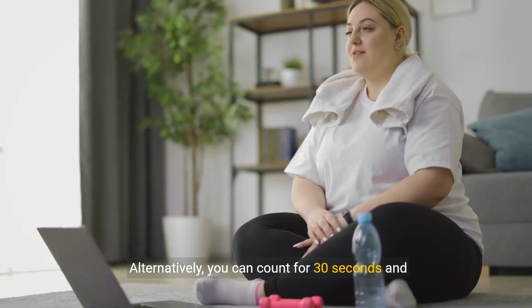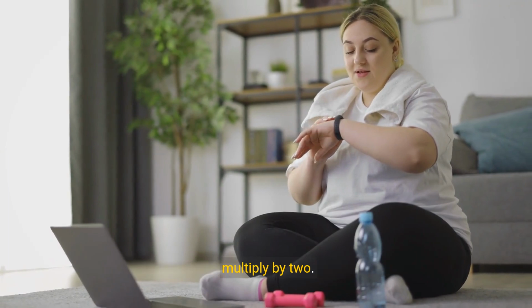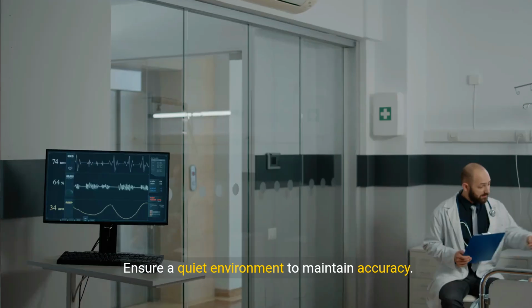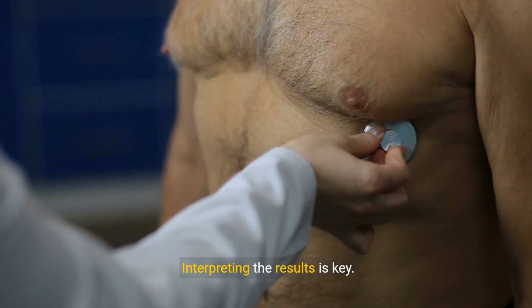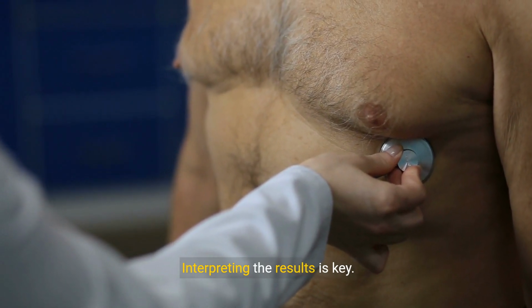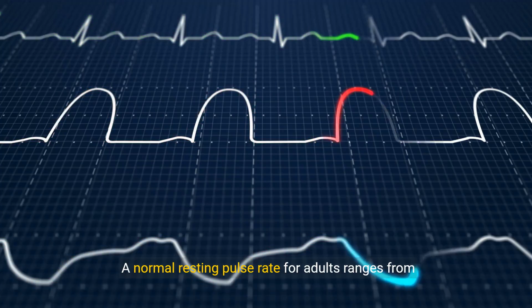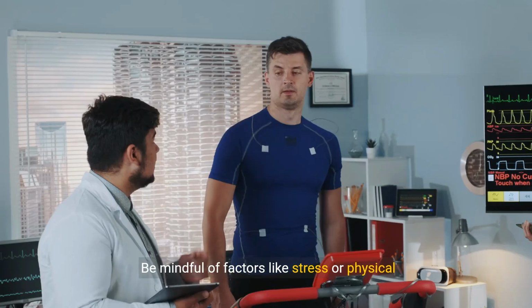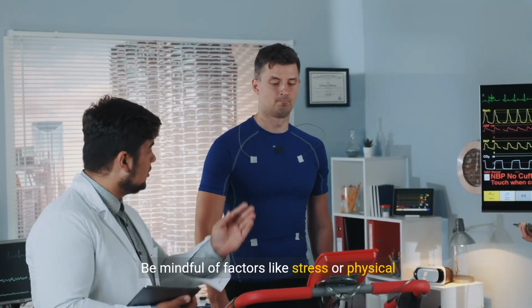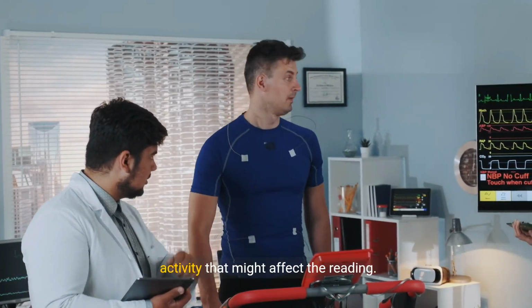Alternatively, you can count for 30 seconds and multiply by 2. Ensure a quiet environment to maintain accuracy. Interpreting the results is key. A normal resting pulse rate for adults ranges from 60 to 100 beats per minute. Be mindful of factors like stress or physical activity that might affect the reading.